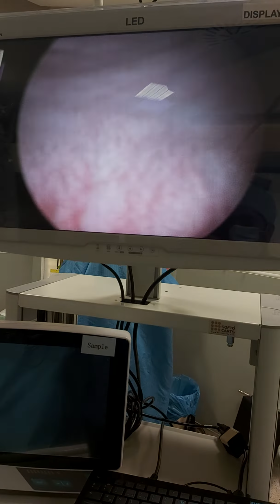It's important to choose the right side, right place, mark the necessary part. If you make too wide a fulguration, the recovery will be too long. If you mark very little, if you mark the fulguration less, then the healing will not be enough. So we have to mark the right places.